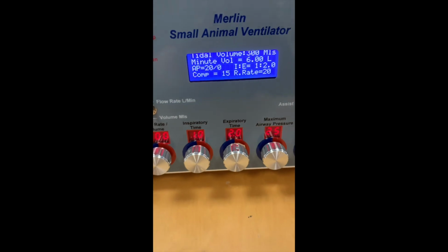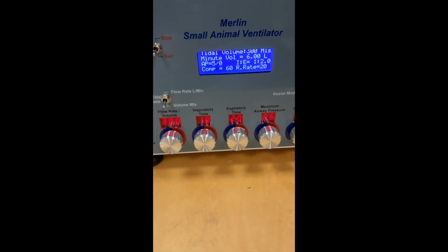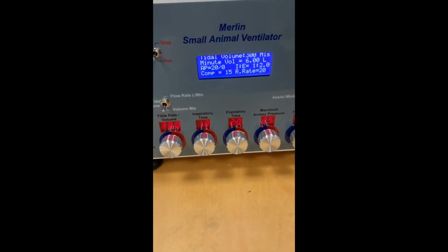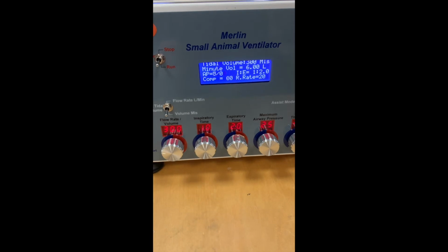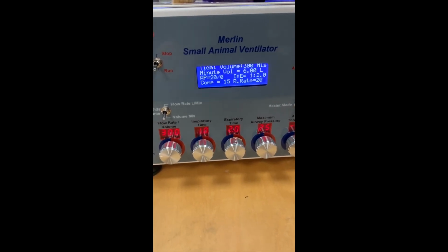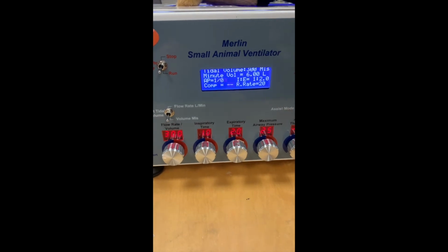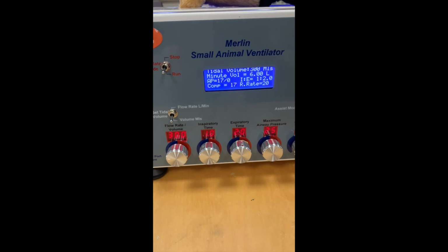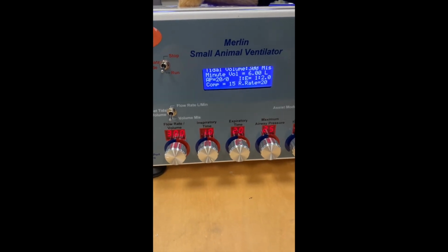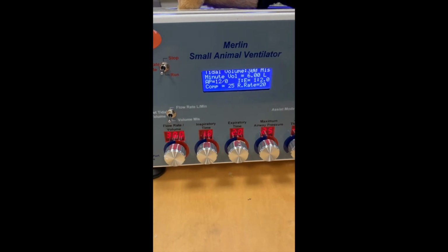So simply, that's it. That's how you set up volume cycling, and those are the results you get, and the machine will continue to do this for as long as required. In testing, all our machines run for 7 days solid, continuous testing, and they obviously will run longer, but testing is all done at 7 days. Right, so what we can do now is change to pressure cycling mode and see if we can emulate what we've got here just by changing the approach, but aiming to achieve the same result.